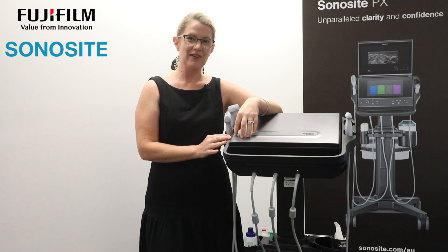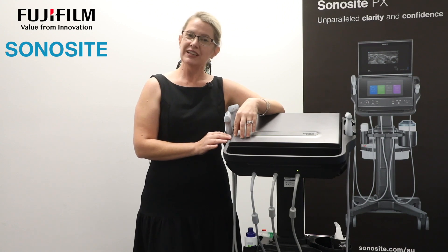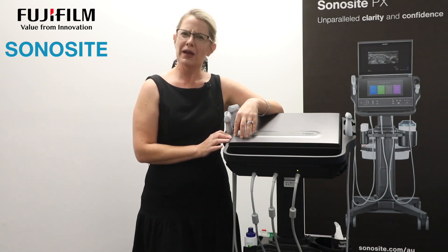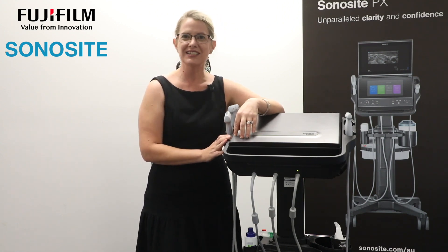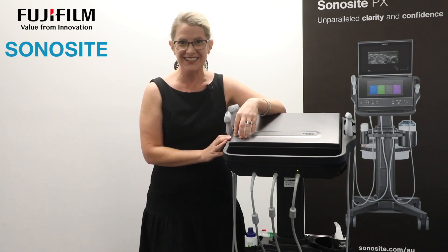A lot of Sonosight customers have come with us as our products have developed over the years and have really been forthcoming with their feedback, telling us 'if only there was this,' 'if only you could give us that,' 'wouldn't it be great if there was this.'